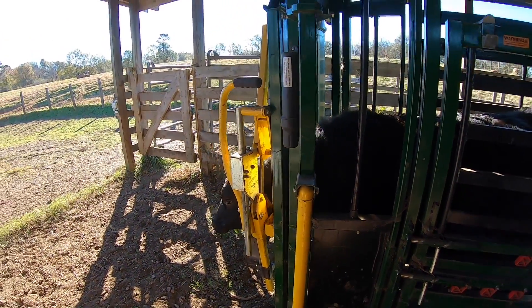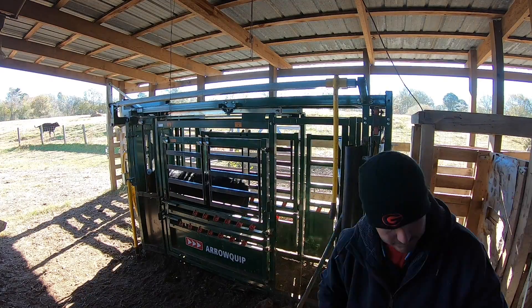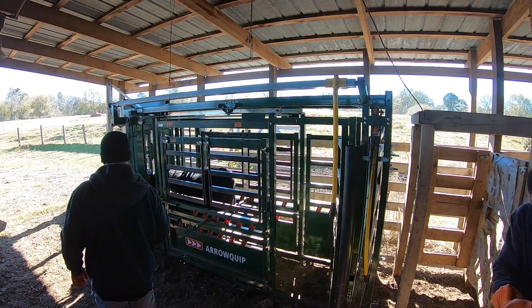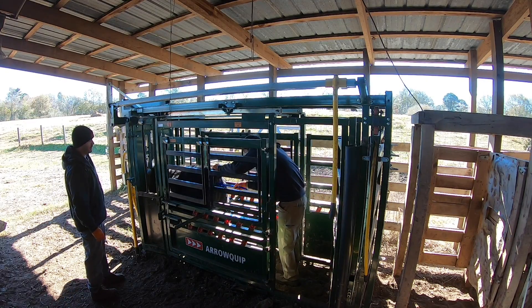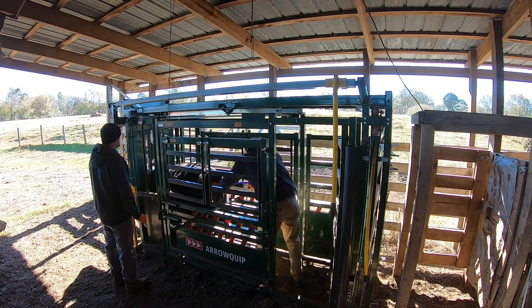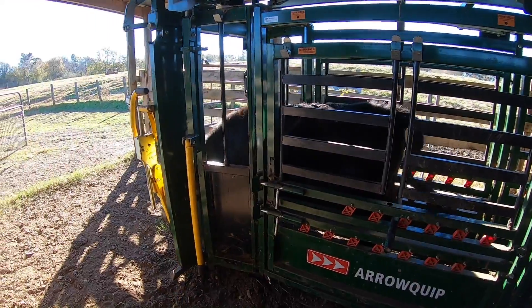And she's good to go. Turn her out. See you in a week, girl. CIDRs are in, they've all gotten a shot. We'll let them sit for seven days, come back, CIDRs come out, we'll give them another shot, stick a heat patch on them, and then we start our timer for breeding. Thank y'all for watching — be sure and tune in to our next couple of videos to see what happens with the breeding.